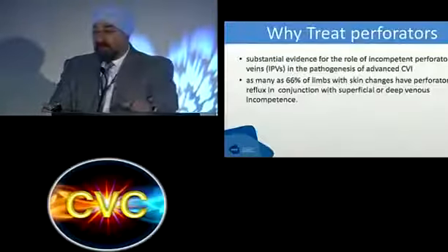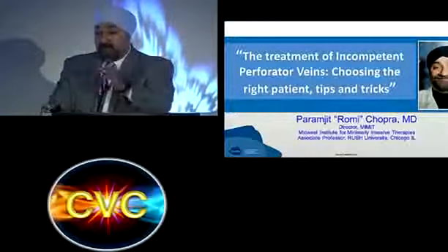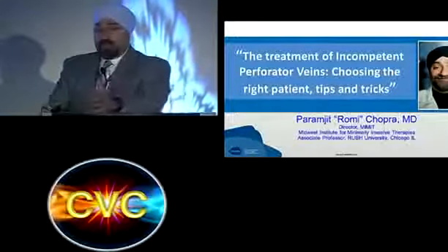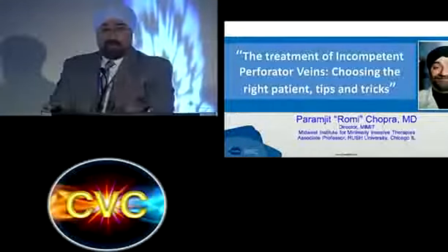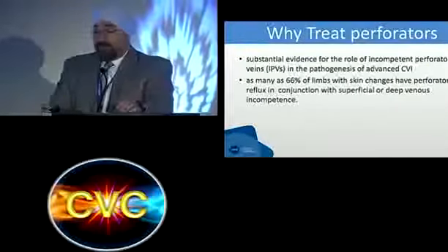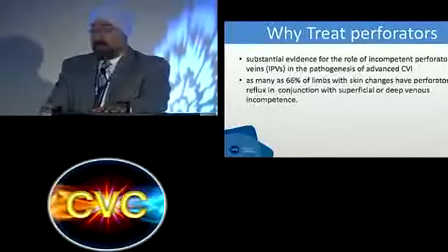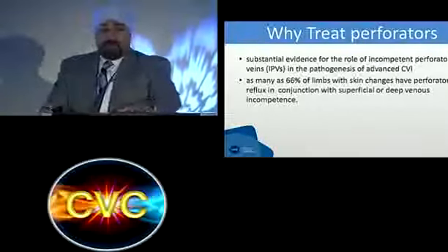Good for the patient. And the very first question that comes, and what we're going to look at with the right patient, the tips and tricks, and I'll show you a video of how we actually do it and walk through it. And the question is, why do we treat perforators?